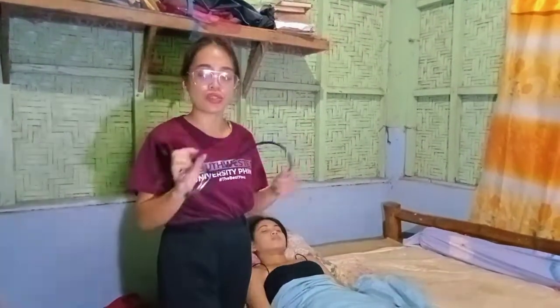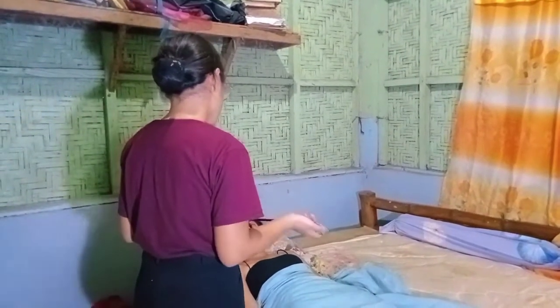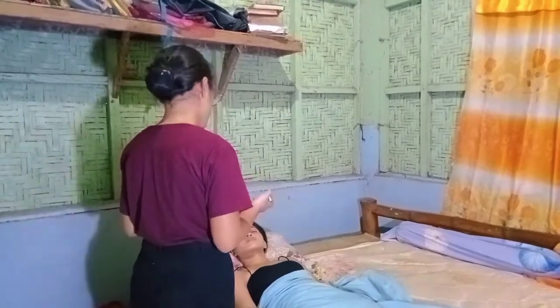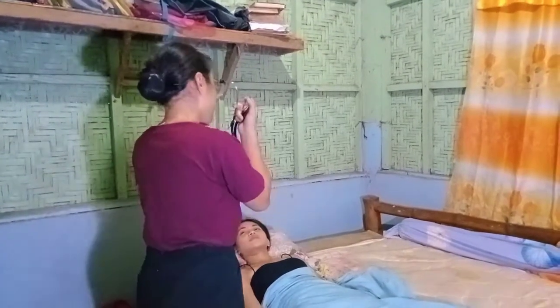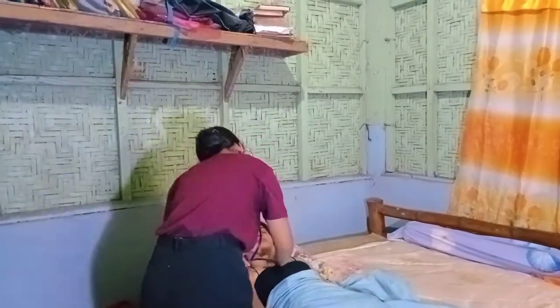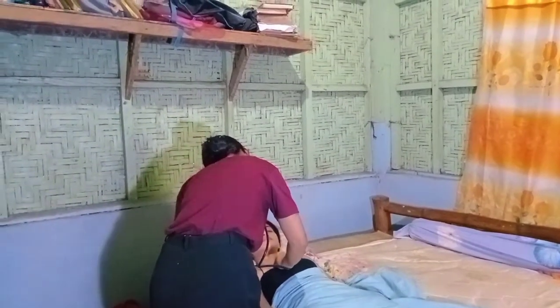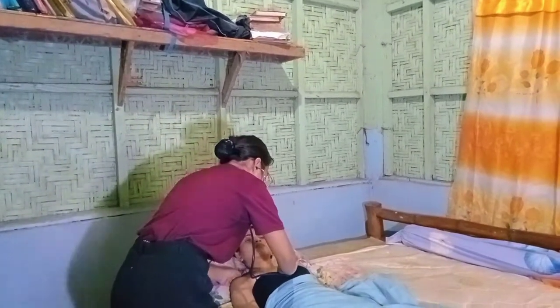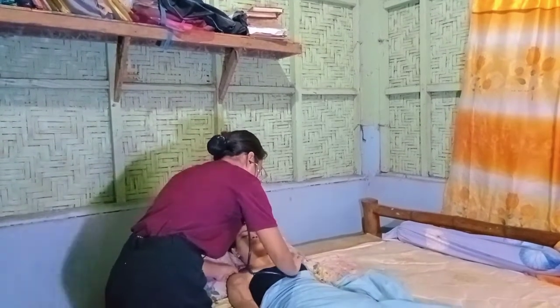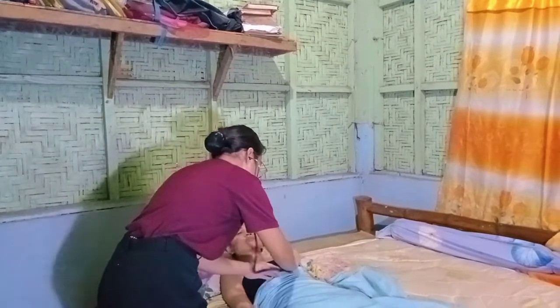So I'm using my stethoscope. Use the diaphragm to hear the heartbeat. Okay, right now, ma'am, I'm going to auscultate the cardiac landmarks to check your heartbeat. And I want you to breathe normally, okay? So, pulmonary area. Then down to the Erb's point. And to the tricuspid valve.